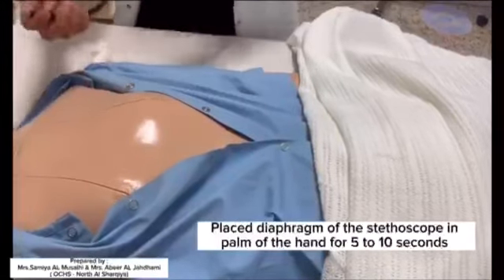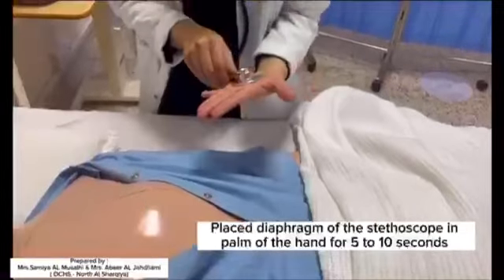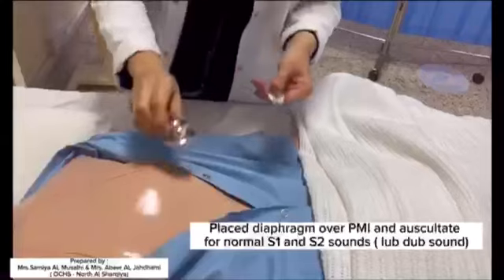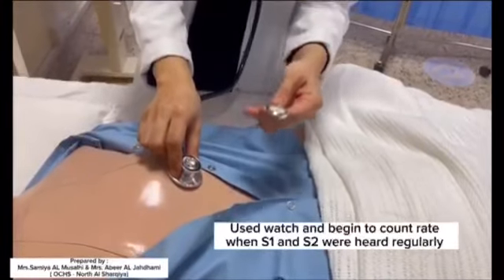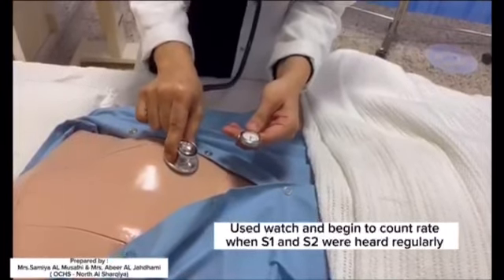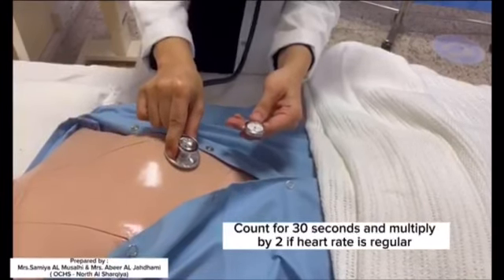Place diaphragm of the stethoscope in palm of the hand. For 5 to 10 seconds, place diaphragm over PMI and auscultate for normal S1 and S2 sounds, the lub-dub sound. Use watch and begin to count rate. When S1 and S2 are heard regularly, count for 30 seconds and multiply by 2 if heart rate is regular.